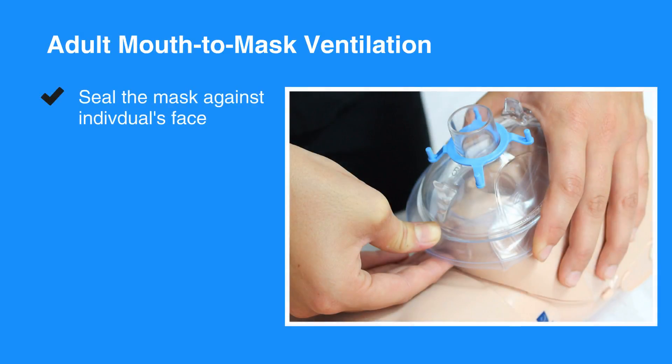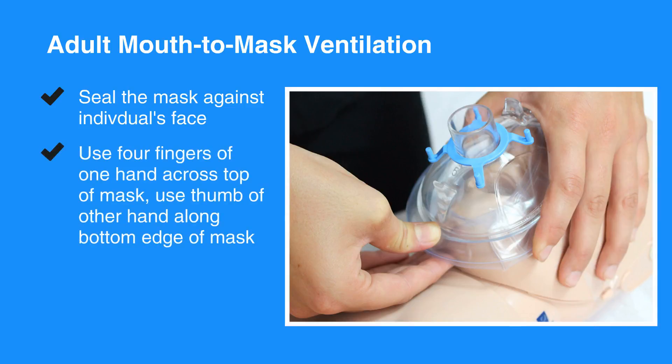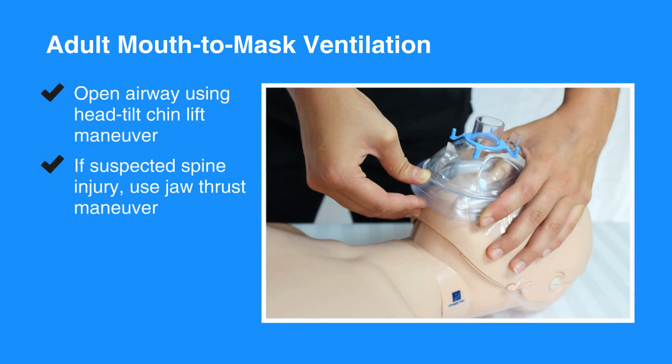Next, seal the mask against the individual's face by placing four fingers of one hand across the top of the mask and place the thumb of the other hand along the bottom edge of the mask. Using the fingers of your hand on the bottom of the mask, open the airway using the head tilt chin lift maneuver, unless you suspect that the individual may have a spine injury.